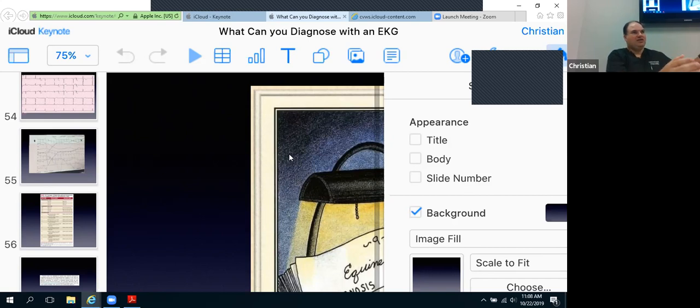If it's coming up here, that means you're missing that. If you're missing that, that's the infarct, and it's not giving you the signal. We're looking for strengths of signal and for the axis of that signal. This is why it gets difficult with the diagnosis, because you know where the electrical signal should be coming from, and you have it at all these different angles.